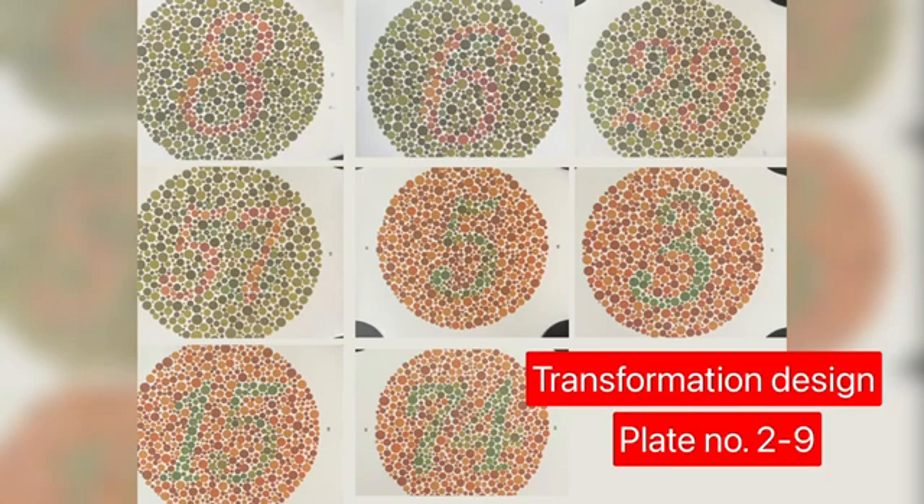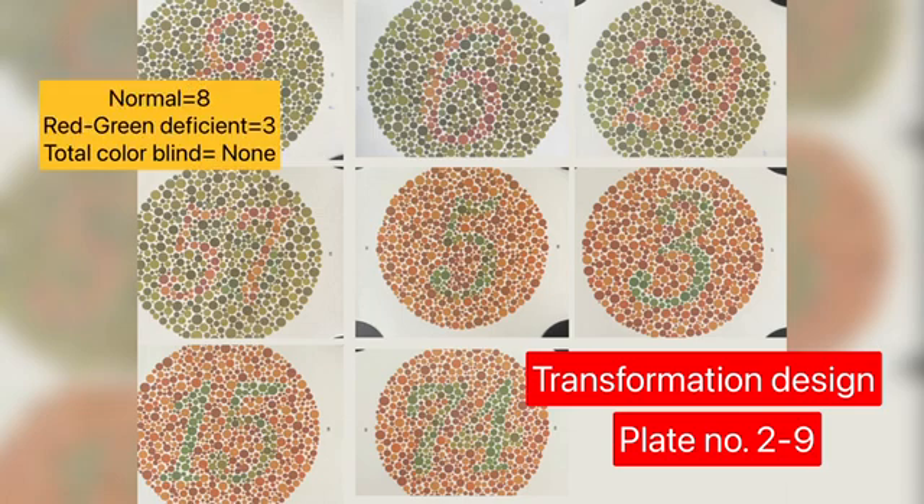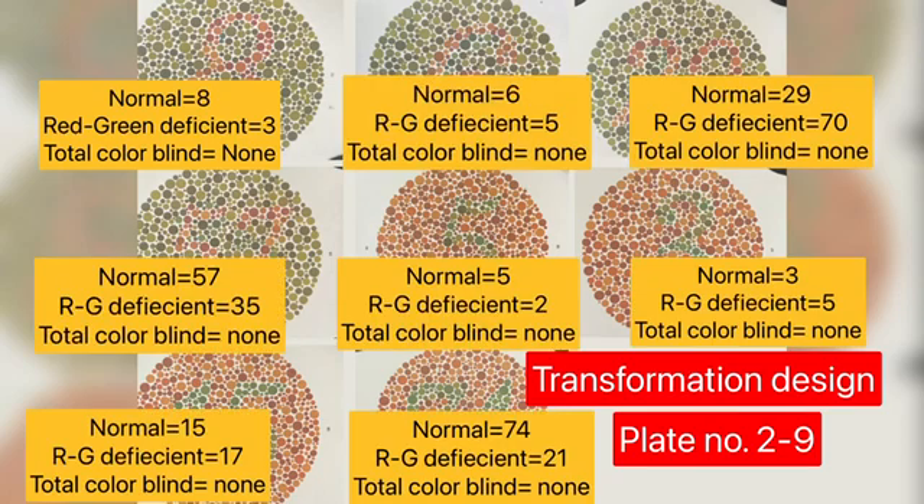The first set of plates are transformation designs, which are read differently by color deficient and completely colorblind patients, whereas patients with normal color vision will read them correctly. These are plates number 2 to 9. For example, on the first plate, a normal patient will read it as 8, whereas a red-green deficient patient will read it as 3, and total colorblind patients — monochromats — will read nothing.